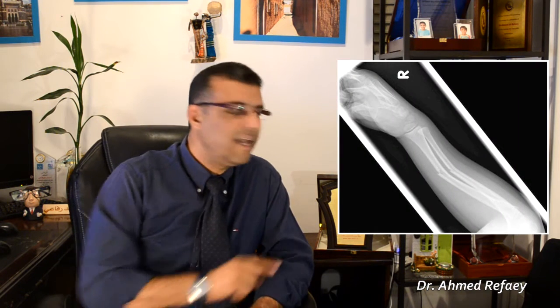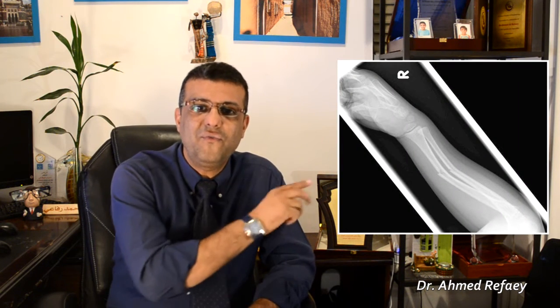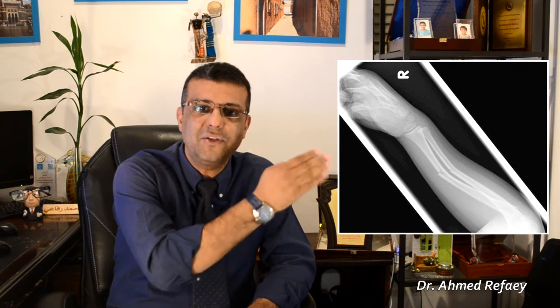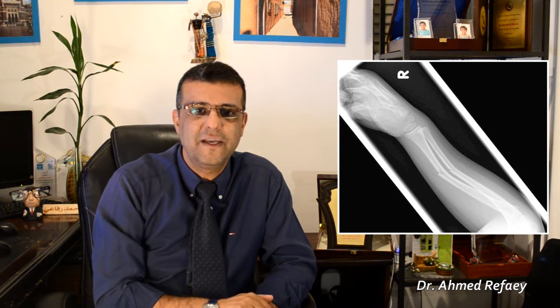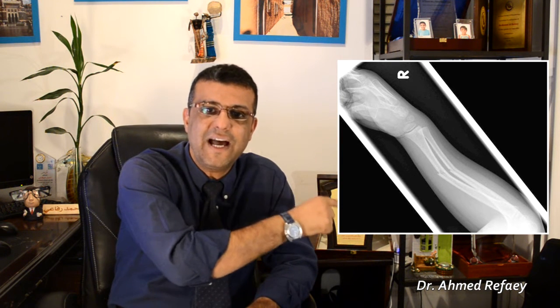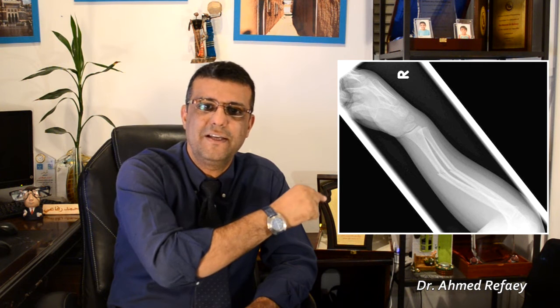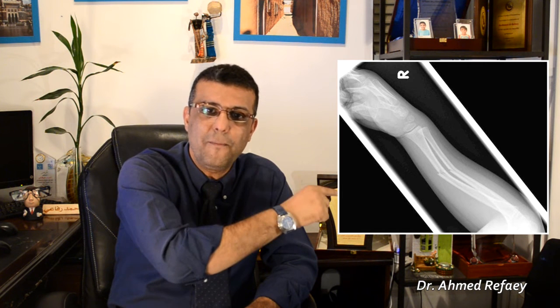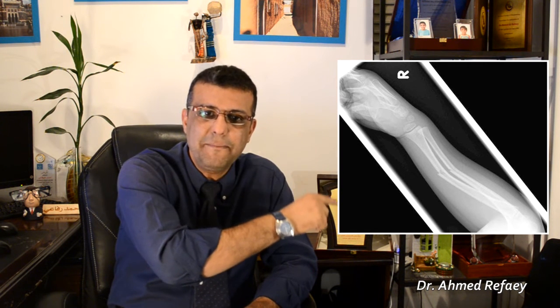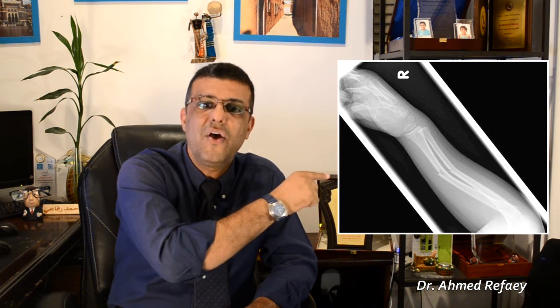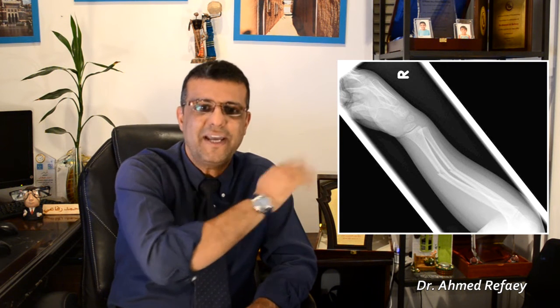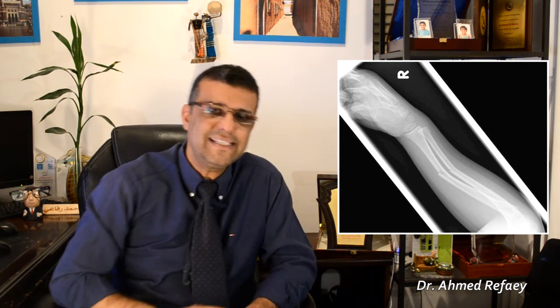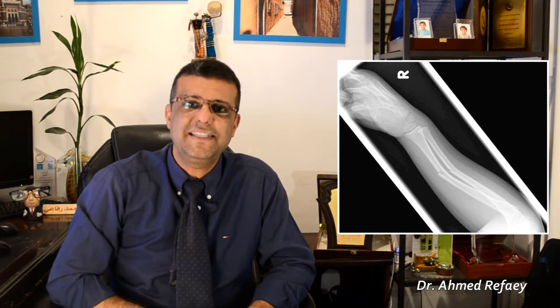Case number five. This is an incomplete fracture because it involves only part of the cortex, not reaching to the other side, involving the shaft of the right ulna and radius. It is an incomplete, oblique, simple fracture associated with posterior angulation. This is what is known as a greenstick fracture.